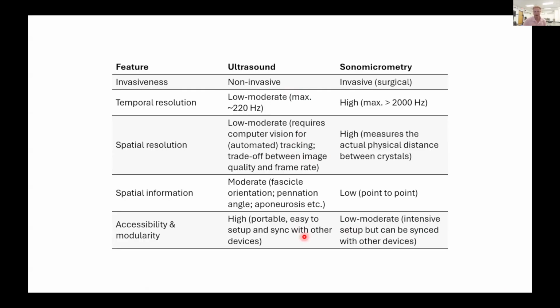The main real drawback here is the temporal resolution, so maxing out at around 200-ish frames per second if you're really sacrificing image quality, as well as the fact that there's a reliance on computer vision, which obviously isn't without its bugs and problems as well.